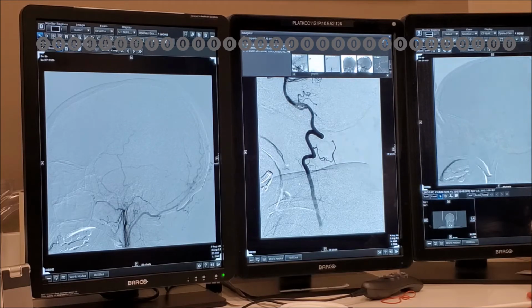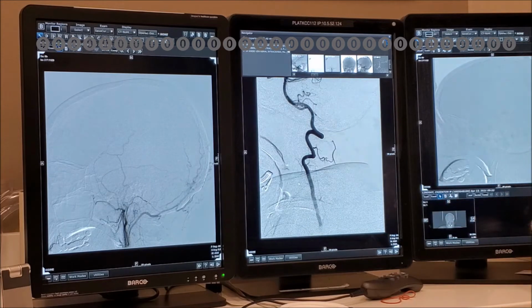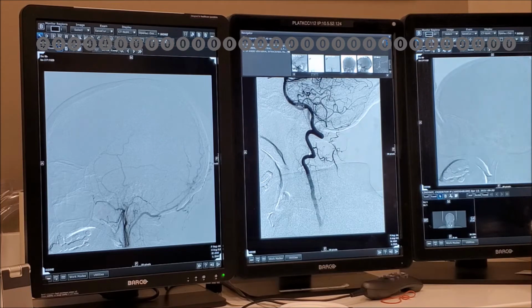And how do I differentiate a spinal cord artery from the odontoid? This one always projects posterior to the vertebral. This one will project anterior to the vertebral. See? You see it here? Whereas here we see now the upper part, which I was looking at in the AP, but there's so much movement. But now you see clearly the odontoid process. You see how it's exactly the same thing. Agree?